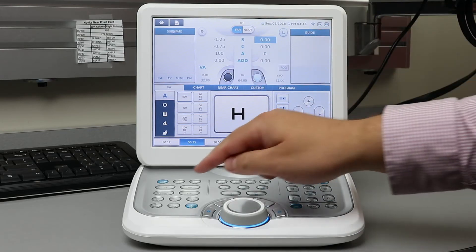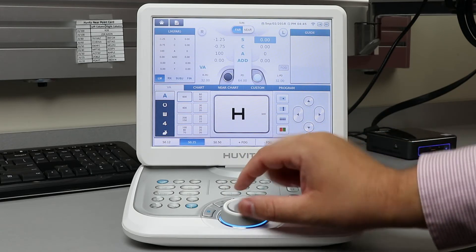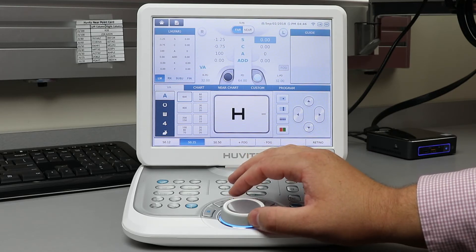Next, hit the subjective button on the keypad. Now your information will be displayed on the left-hand side. Use the dial to begin your refraction — 1 or 2, 1 or 2.